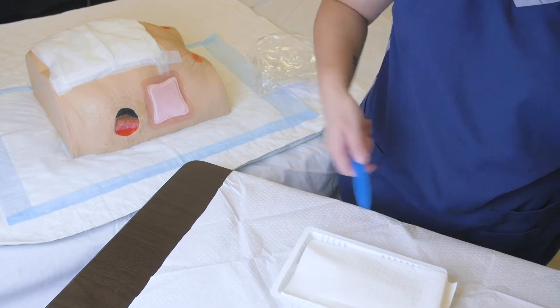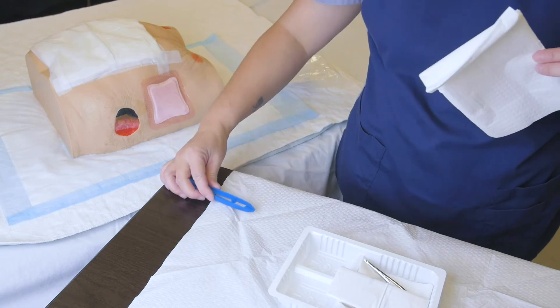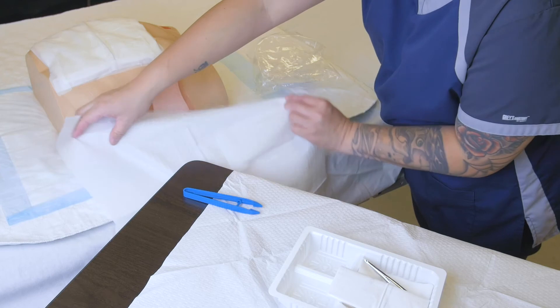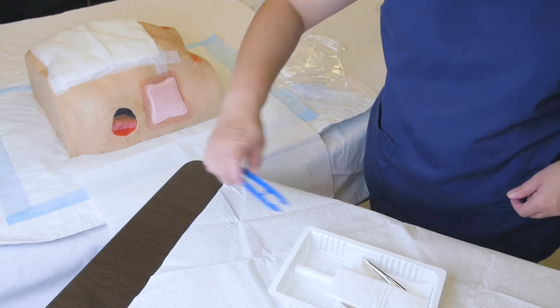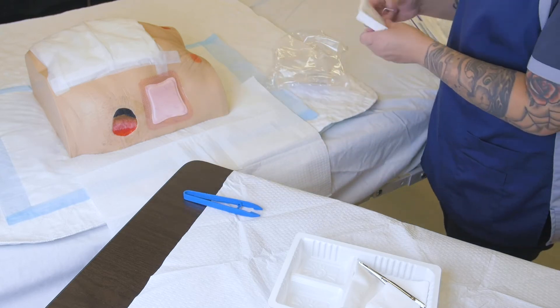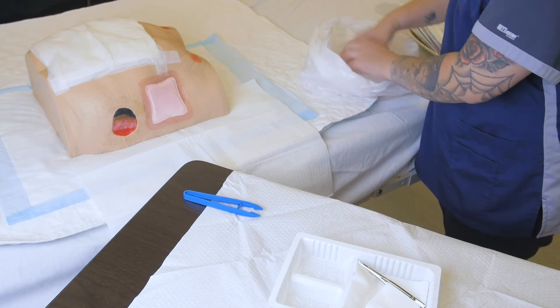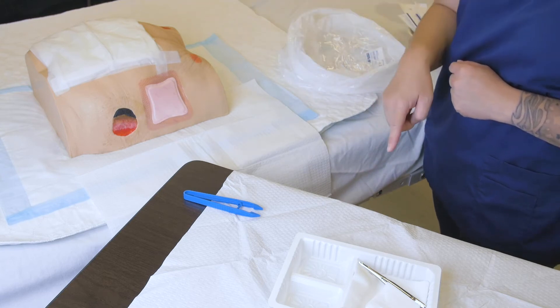We're going to pick up our drape, which we'll use as a clean drape to absorb any spills when we start irrigating. We open it up away from our field and set it underneath the patient — we'll ask our patient to turn a little bit. Then we pick up our garbage bag and set it up towards the foot of the bed. We want to maintain a triangle shape between the dressing kit, the wound or patient, and the garbage bag, so that we avoid cross-contamination.